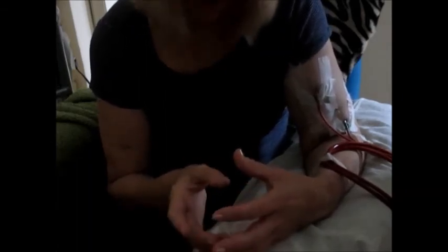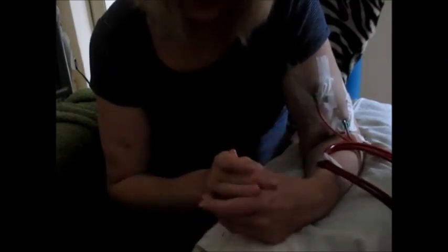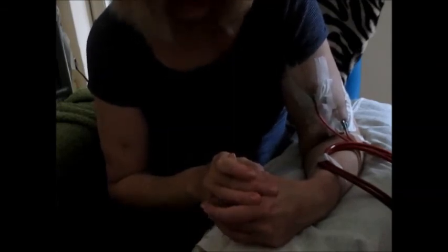So that's it for now. I'm going to get on with the rest of my treatment and I'll show you at the end how to remove the needles. Thank you.